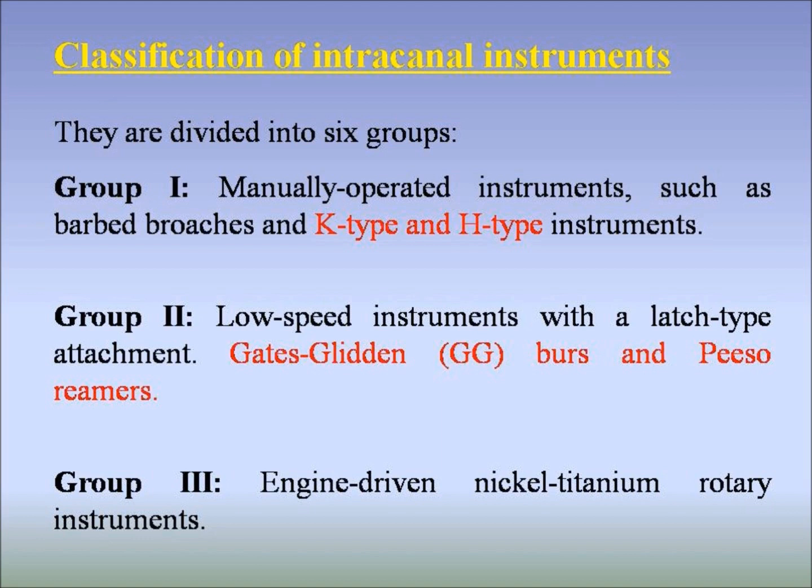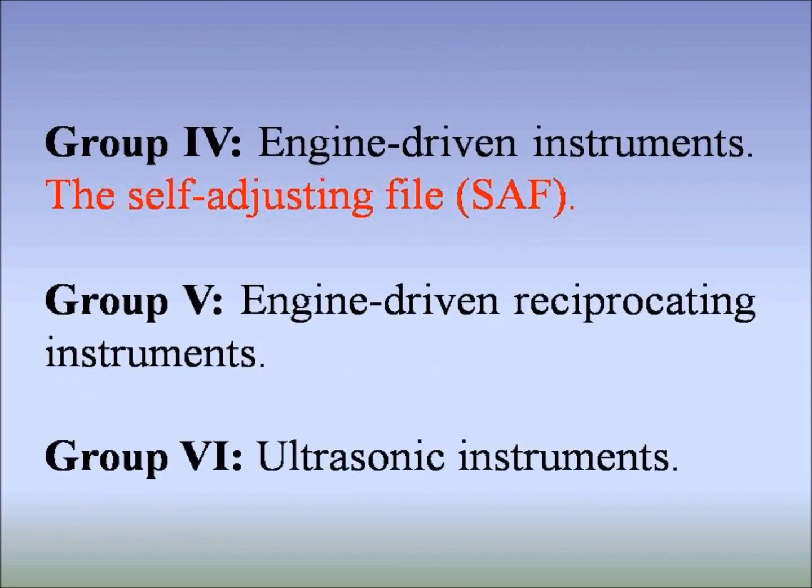Group 3, engine-driven nickel titanium rotary instruments. They consist of rotating blades that can safely operate in and adapt themselves to curved root canals. Most engine-driven instruments available today belong to this group.